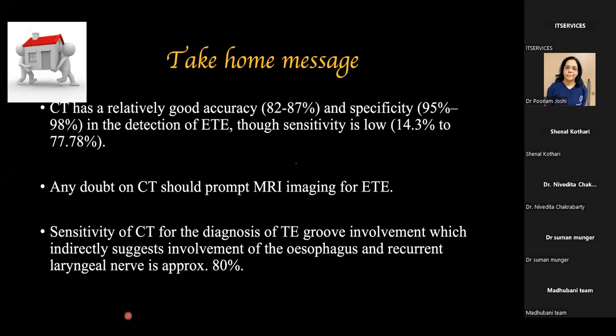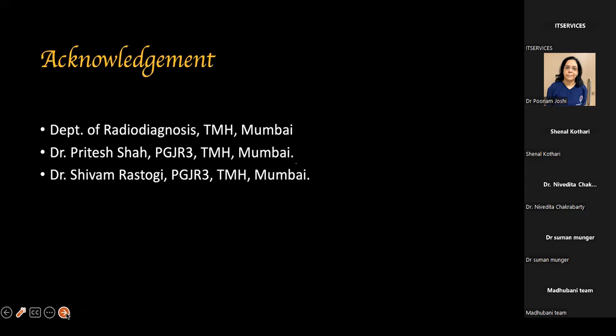So any doubt on CT should prompt MRI imaging for extrathyroid extension, because that will help in your surgical planning. Now, sensitivity of CT for diagnosis of tracheoesophageal groove involvement, which indirectly suggests involvement of the esophagus and recurrent laryngeal nerve, is approximately 80%. So I thank my residents for helping me out with the images.